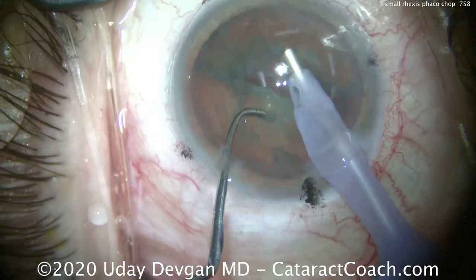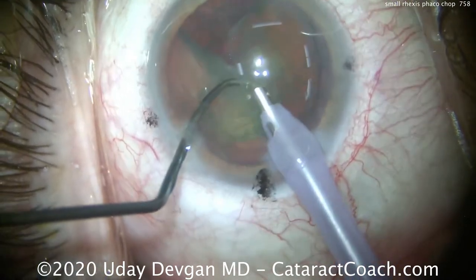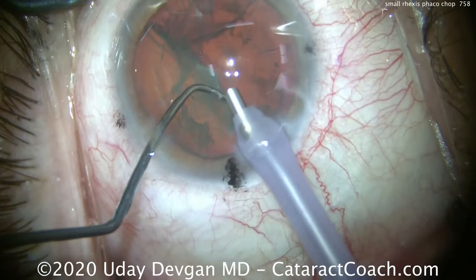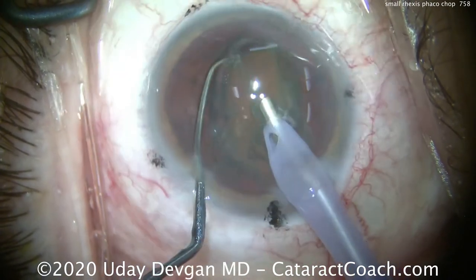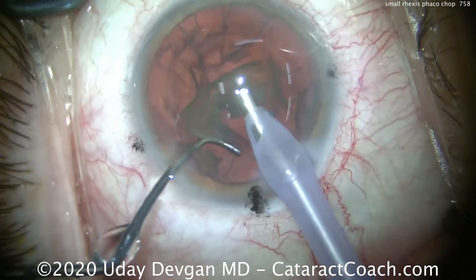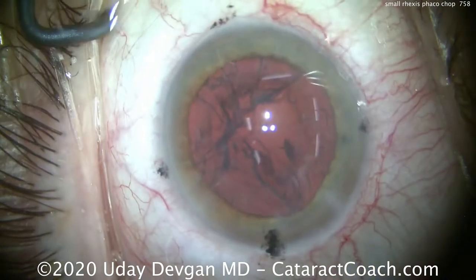So instead, we'll get that heminucleus and sub-chop it into smaller pieces and then emulsify it. The main constraint in doing phaco chop with a smaller capsulorhexis is that we have to bring those nuclear pieces up through it. Buzzing in again, bringing up one corner of the heminucleus then chopping it — that way we can bring up that corner through the smaller capsulorhexis. And you can see we make short work of the nucleus removal. That goes beautifully.